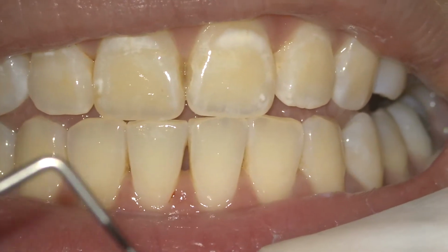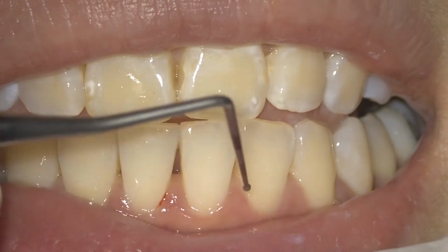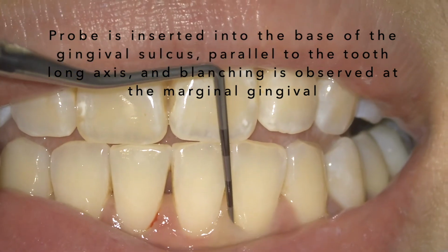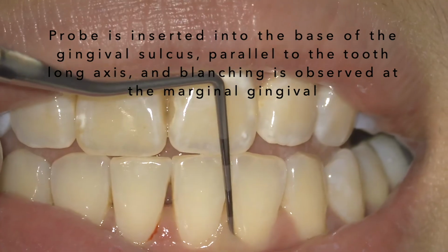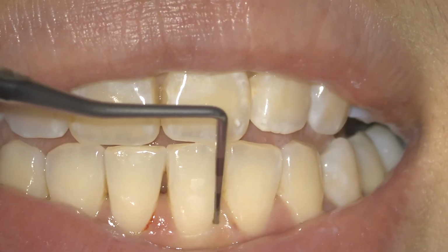Now let me show you the same bleeding on probing assessment on the lower anterior teeth. As you can see, I am using my probe parallel to the long axis and inserting into the base of the sulcus. You can observe the blanching of the gingiva, and then you can take it out. Then do the same on the mesial half of the papilla, go inside and come out.